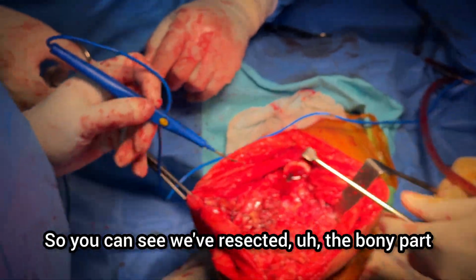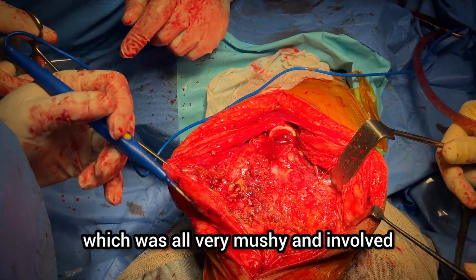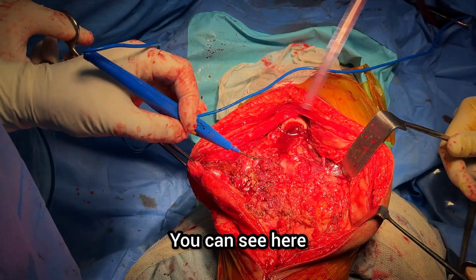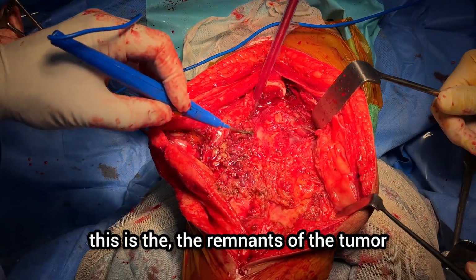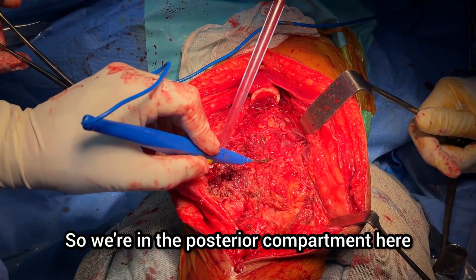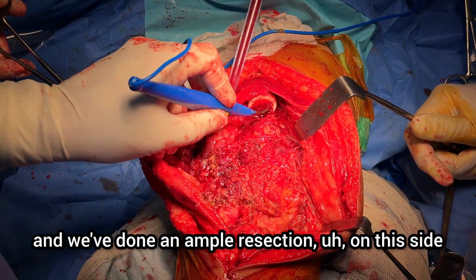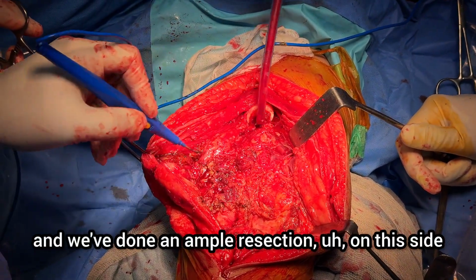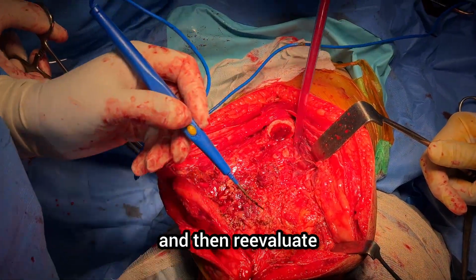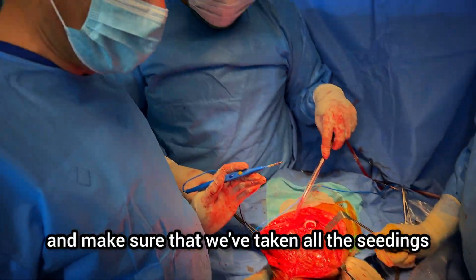So you can see we resected the bony part, which was all very mushy and involved, and posteriorly there was significant compromise. You can see here, this is the remnants of the tumor that we're going to meticulously take off as well. So we're in the posterior compartment here, and we've done an ample resection on this side. So you're going to see we're going to take all of this off, debride this, and then wash and reevaluate and make sure that we've taken all the seedings and the soft tissues off.